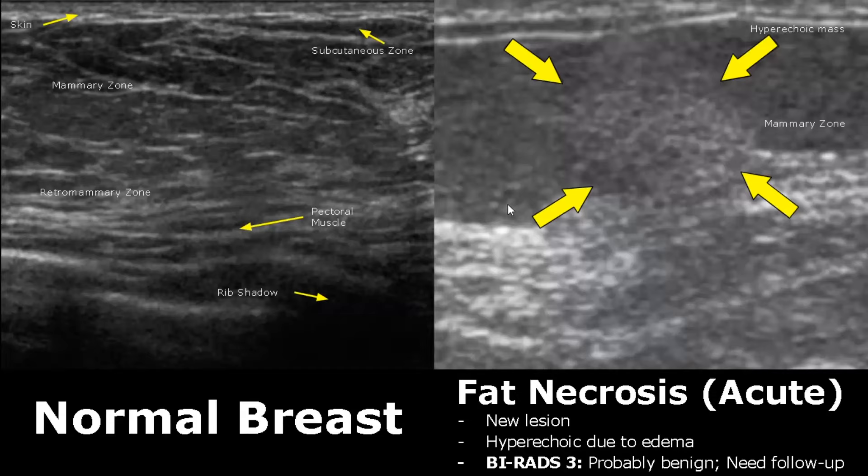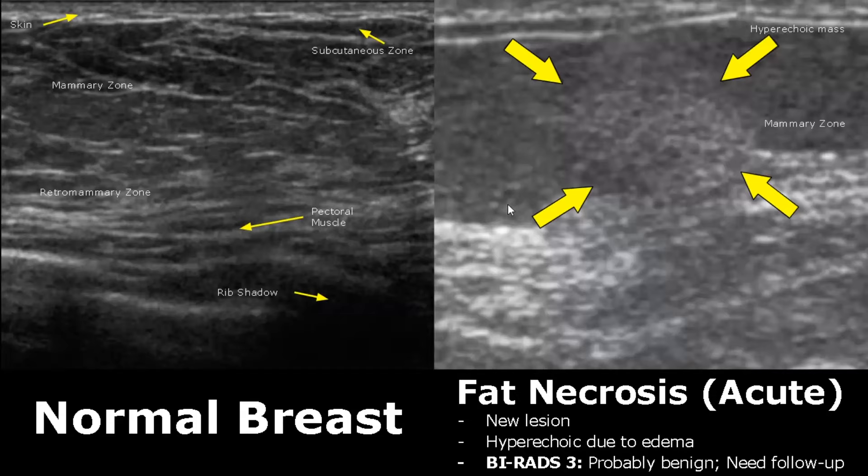Fat necrosis has a variety of appearances. In the acute phase, the lesion is new, so it may appear as a hyperechoic lesion due to edema. Fat necrosis appearances overlap with malignant lesions, so a follow-up is required, and it is rated as BI-RADS 3.